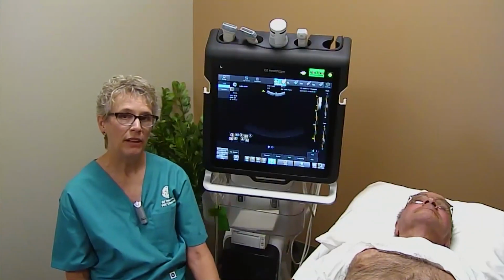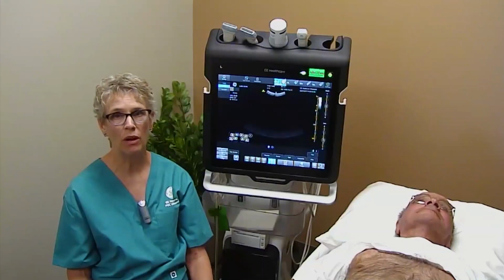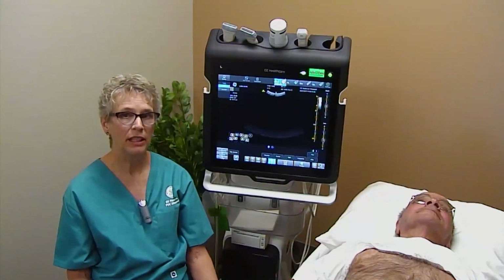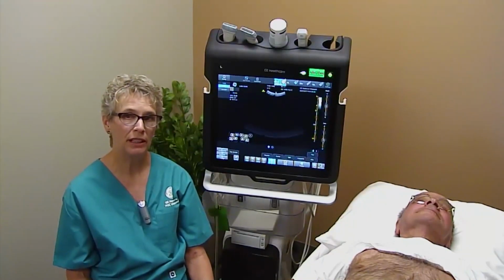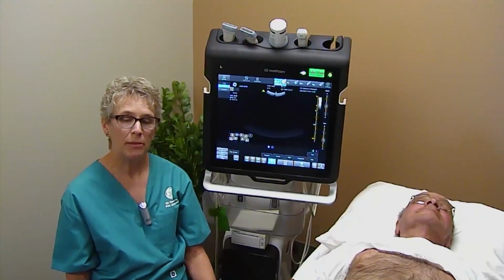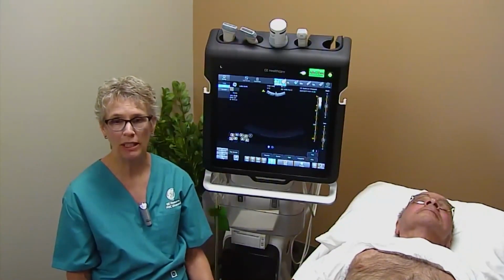The linear array, on the other hand, shows the pleura beautifully. So if you're really looking for consolidations, especially small consolidations, the linear is the way to go. Any kind of pleural irregularity, it's going to show better than the phased array for sure. And it will also beat out the curved array in that regard. But the problem with the linear array is that penetration, of course. It's not going to penetrate quite as far.